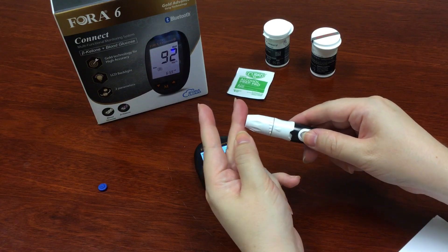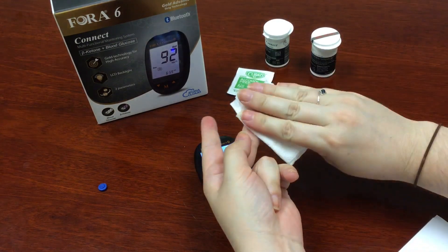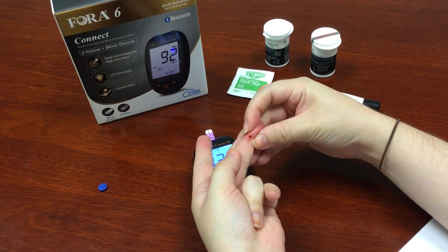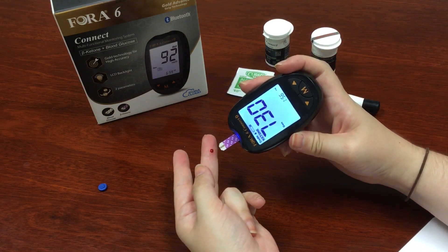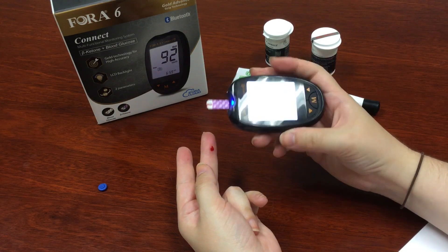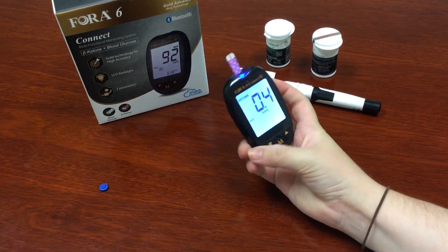Use the lancing device. Remember to get rid of the first drop — just wipe that off. Now hold the meter at an angle again. It'll give a few seconds, and then I have my reading.